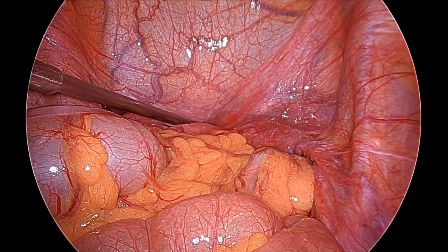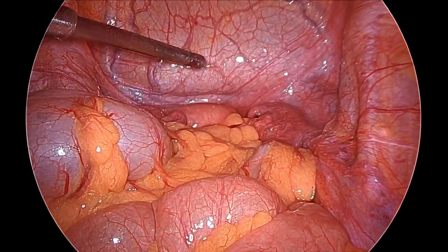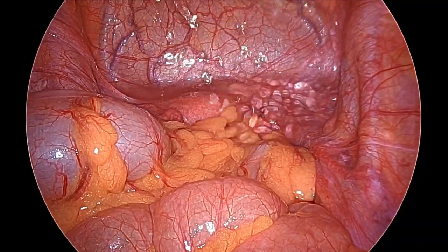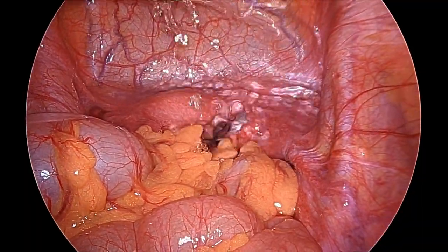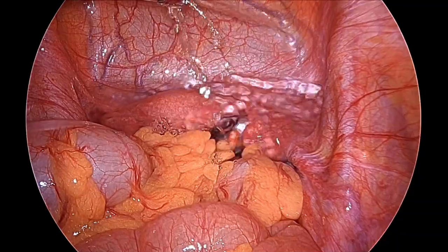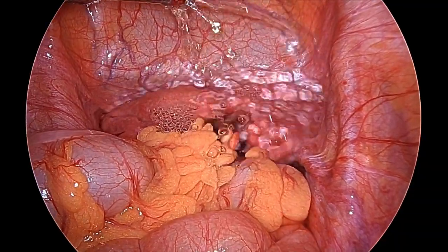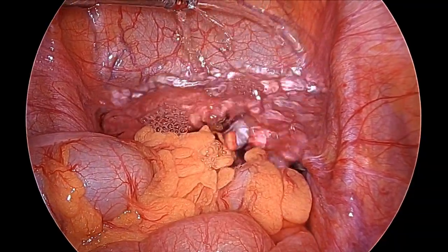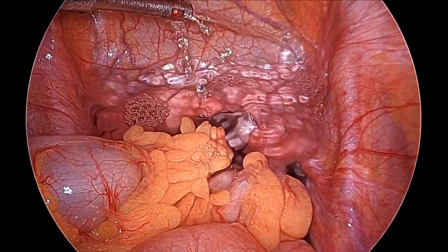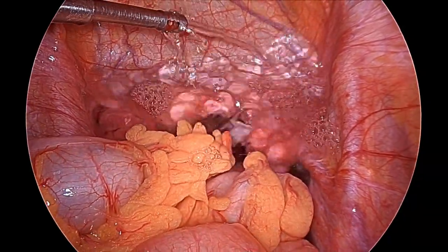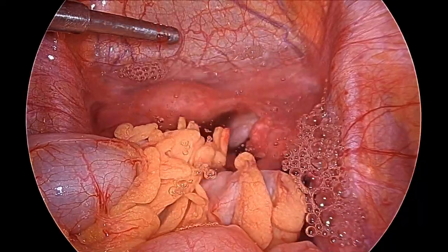A couple of rounds of suction irrigation will be performed, and we will leave at least 500 ml of normal saline inside the pelvis so that adhesions will not develop. Thank you very much for watching this video — this was a simple case of ovarian cystectomy by laparoscopy.